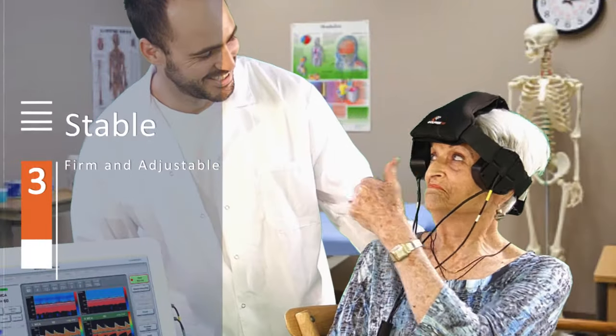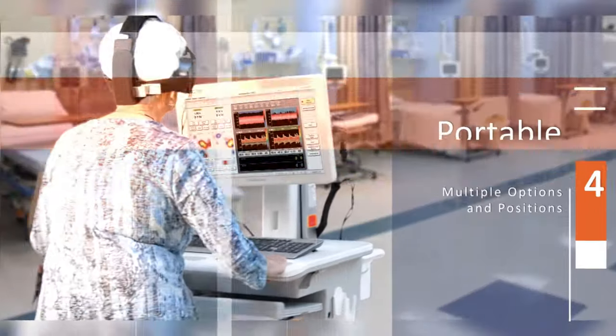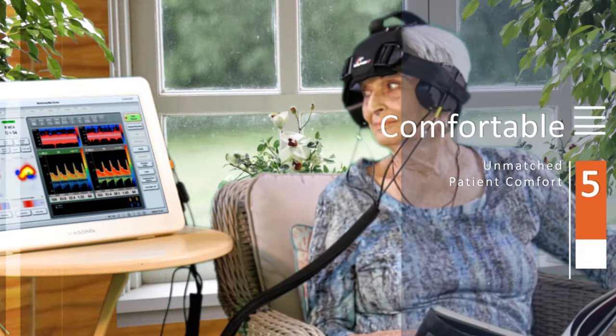Completely stable even with head movements. Ultimate flexibility and portability, and with unmatched patient comfort.